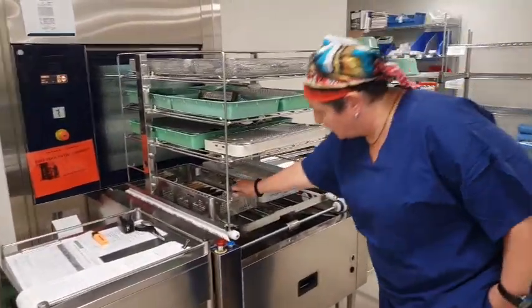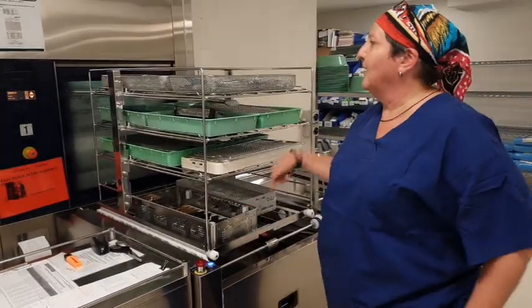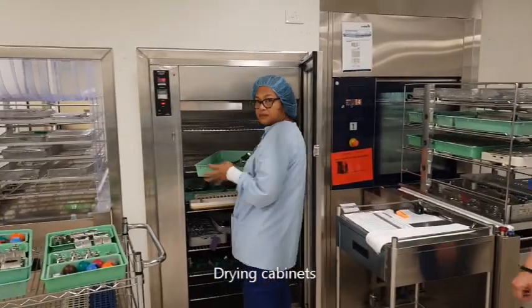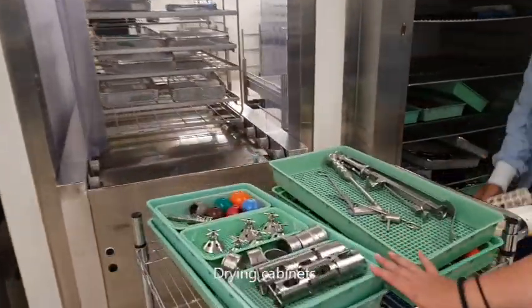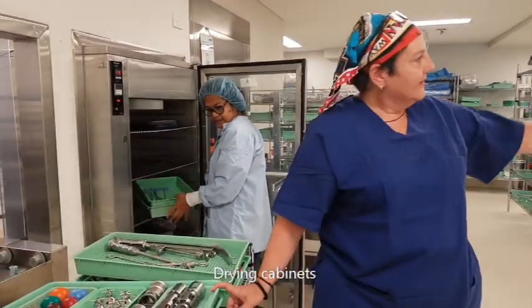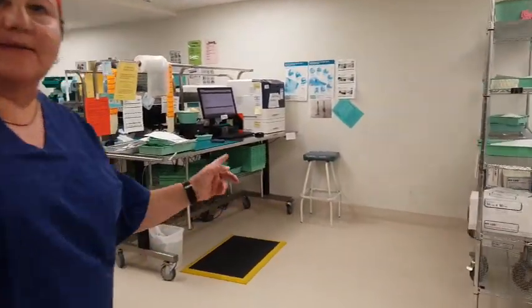And these are the instruments you used today. Yep, that have been washed and come through the washer almost dry. So now they'll go into this dryer for an hour. And these instruments are just coming out of there. I recognise these instruments. Some lucky person's had these instruments today. Yeah, that's right. And then from here, they'll end up on this table over here, and someone will check them in. Once they're all checked in, they'll come back to me and I'll go through them again.